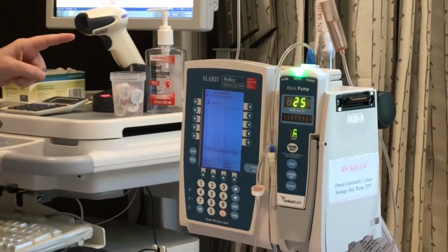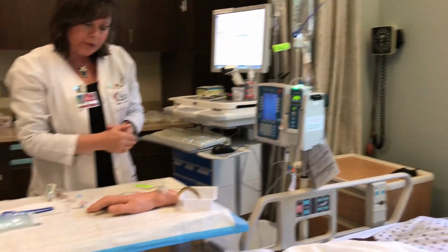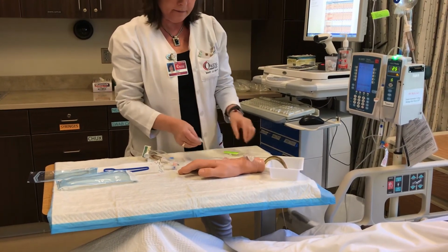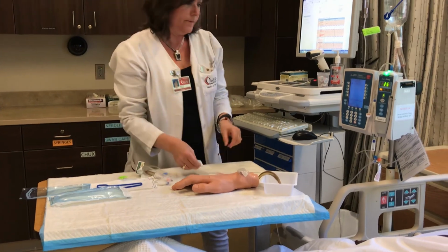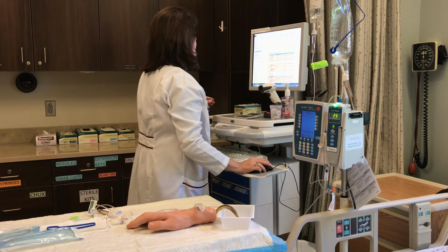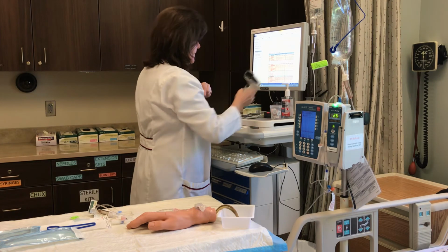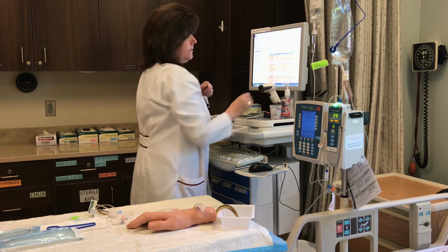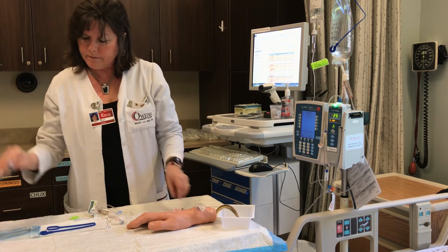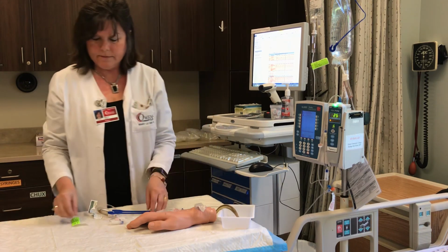I will follow the tubing again down to my patient's insertion site. Note if there's any infiltration, phlebitis, any reaction, and I do not note any of that. Document completed IV piggyback infusion and scan badge. At the end of the procedure, the instructor will note that the student maintained proper body mechanics, maintained patient safety, and maintained sterility throughout and during the procedure.